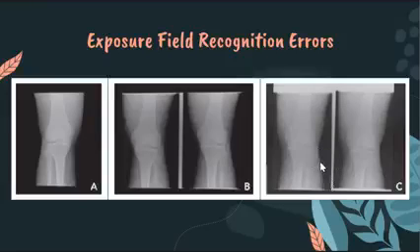So, di ba? When there is an increase in kVp, there is also an increase in incidence of the scatter radiation. And this resulted in exposure recognition error evident at the upper margins of the fields where there is a light strip. So, masyag double dead. Okay? So, wala na gani nabasa ni computer ang area between the two projections. An increased kVp would result also to nag-scatter pa din siya. Okay? So, ganyan siya.